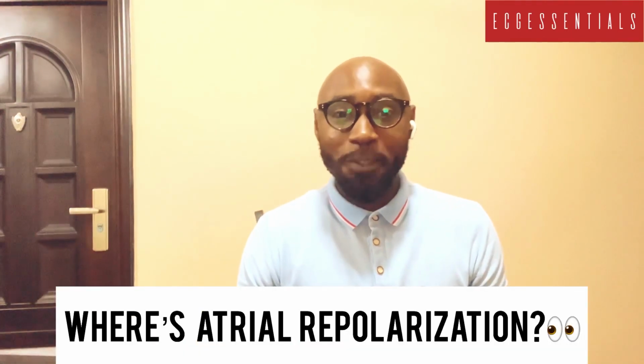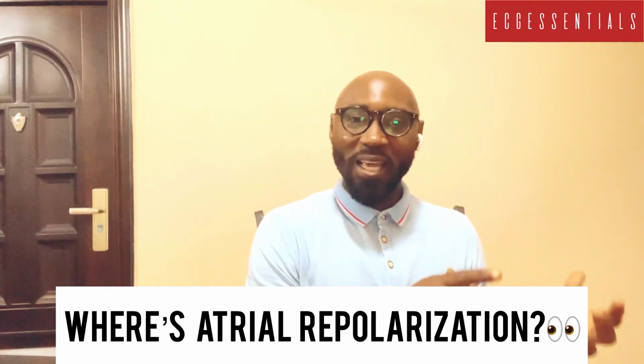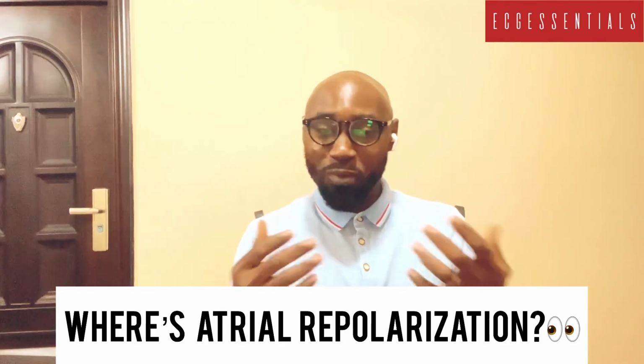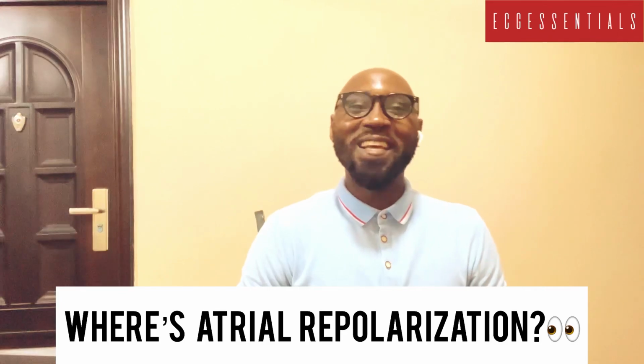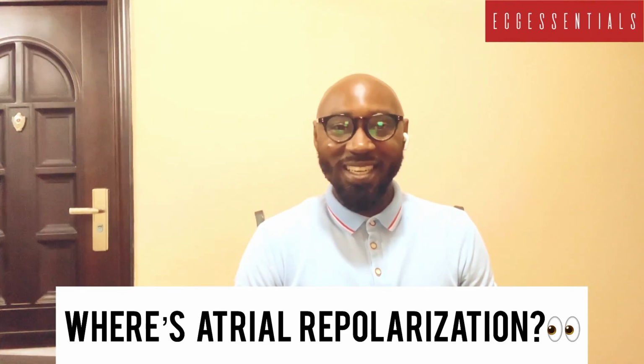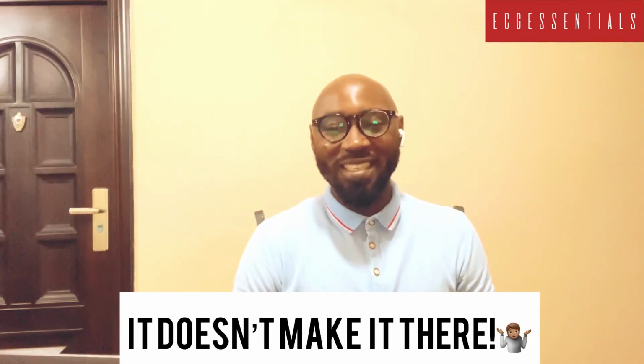At this point, I'm sure some of our audience may be wondering, where is atrial repolarization? We have discussed all the processes that occur, and we have shown their corresponding waves on the ECG, but no mention has been made of atrial repolarization. It's just because it's not there. Atrial repolarization doesn't show up on the ECG.